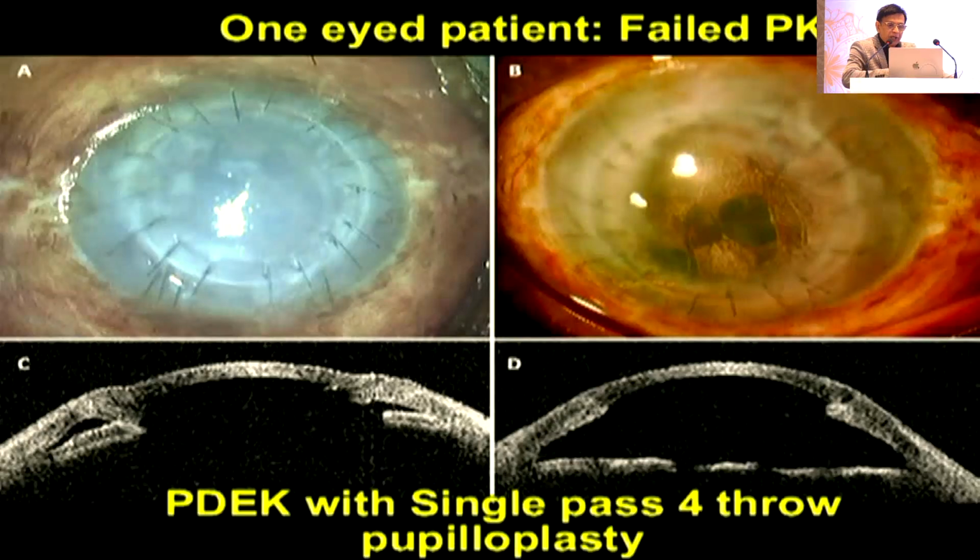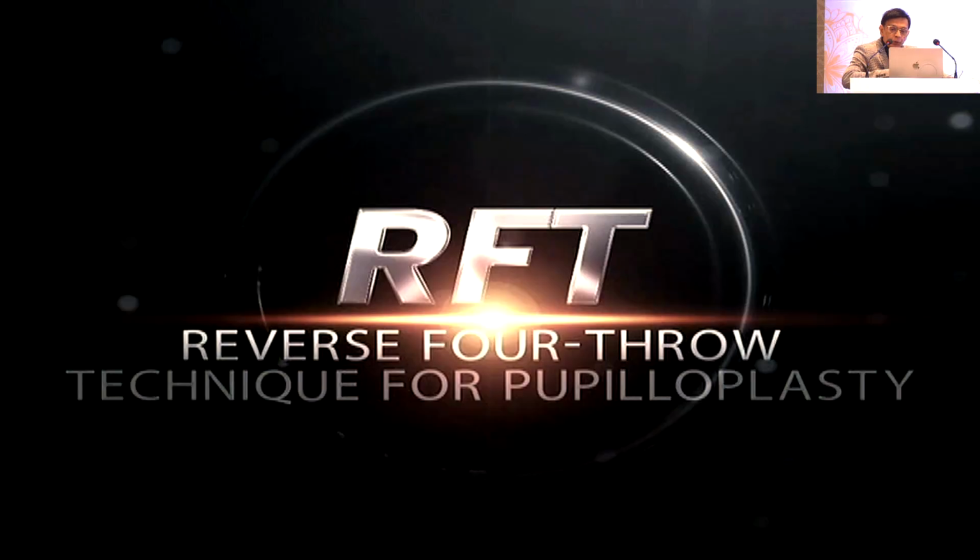Okay. Now look at another patient, one-eyed patient, failed penetrating keratoplasty. Look at the anterior segment OCT below. And now you will understand, post-operatively, we have not removed the cornea. All we did is did a PDEK on the failed graft and make the patient all right. So this is PDEK with single pass, 4-throw pupiloplasty.